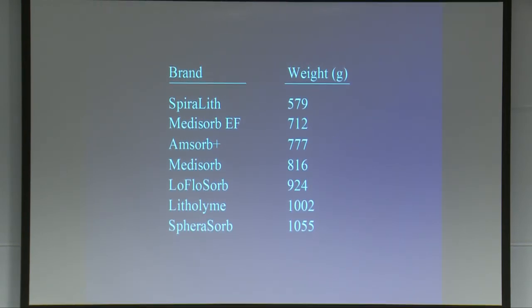And you can see that there's quite a bit of difference in the weight of the actual product in the plastic container. So I'm going to express the same results now as how many minutes in the experimental conditions I outlined, how long does the product last per 100 gram of product.